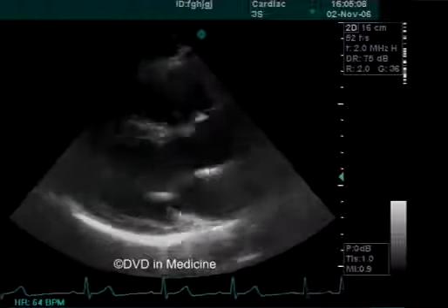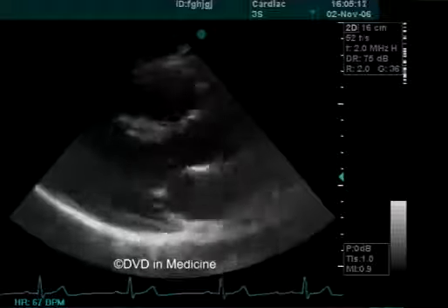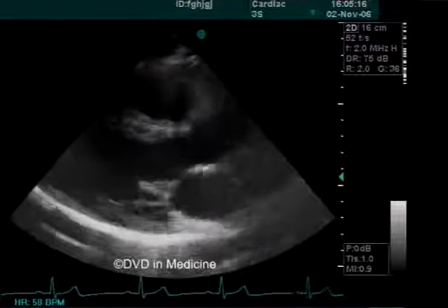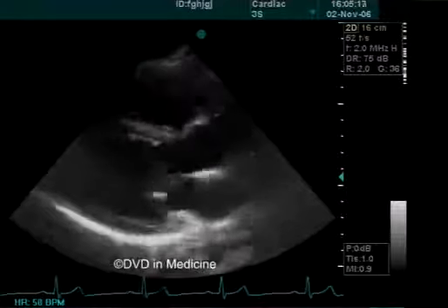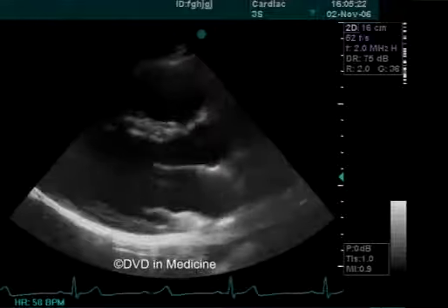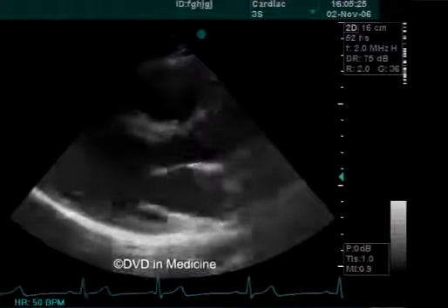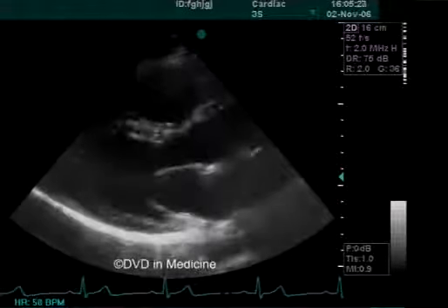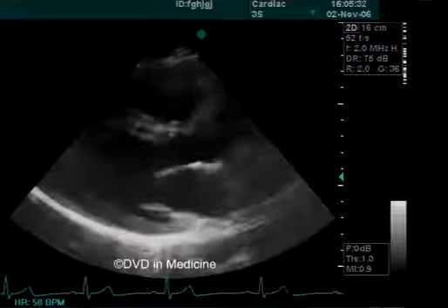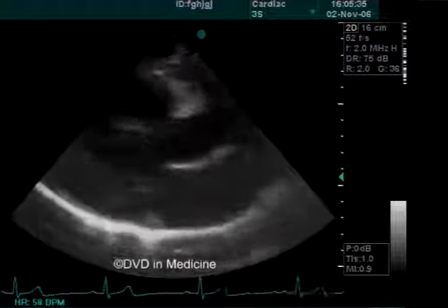6. To see membranous defects of the interventricular septum. 7. To confirm mitral aortic fibrous continuity. This is important in the diagnosis of some congenital heart diseases. 8. To diagnose structural changes and dysfunctions of the mitral valve and its supporting structures, cords, papillary muscles. 9. To diagnose coronary sinus dilation. This can be evidence of persistent left superior vena cava.